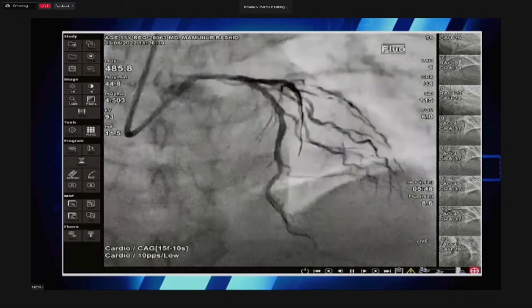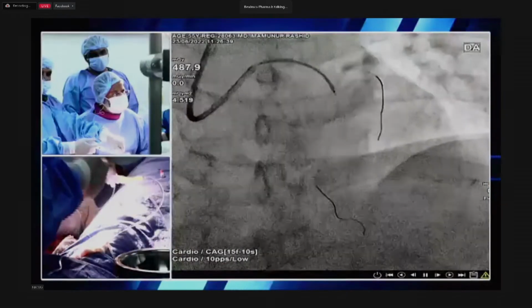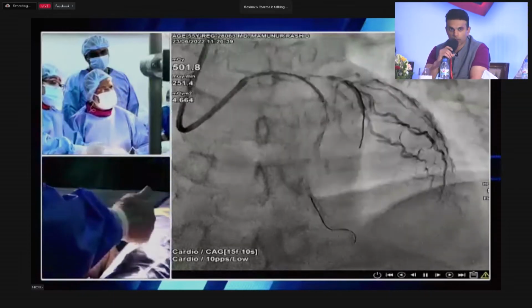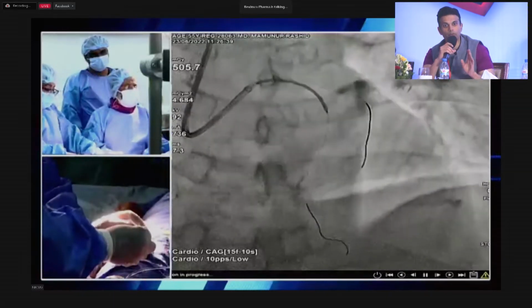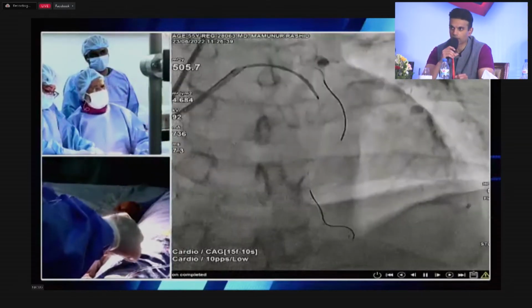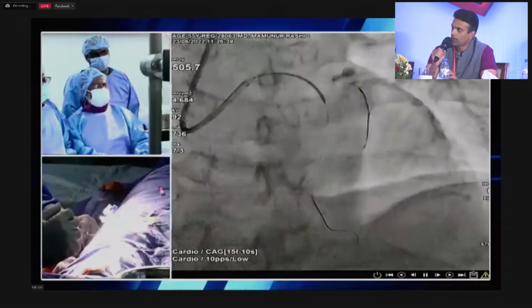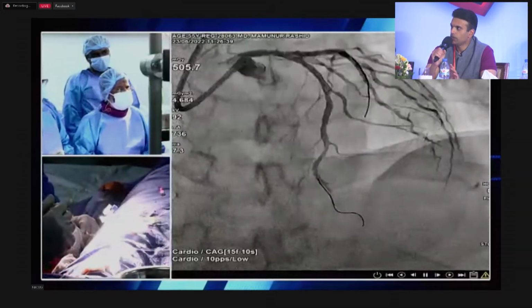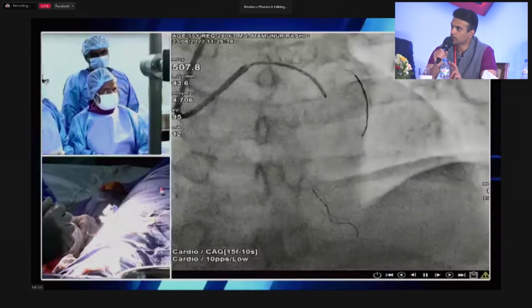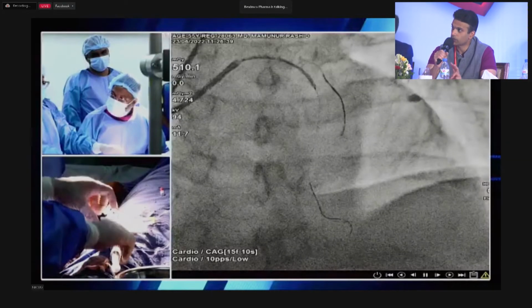It is worth mentioning that if you use the under deployment larger size approach, you've got to have a disease free distal landing zone because your chances of dissection go up quite a bit unless you're landing into normal vessel, because the elasticity of that vessel is different. It is told that we can land over up to 40% of the plaque if necessary. Yeah, you can certainly do that, but then you've got to size it on the IVUS edge to edge on the lumen, as opposed to EEL to EEL, which is a different approach.